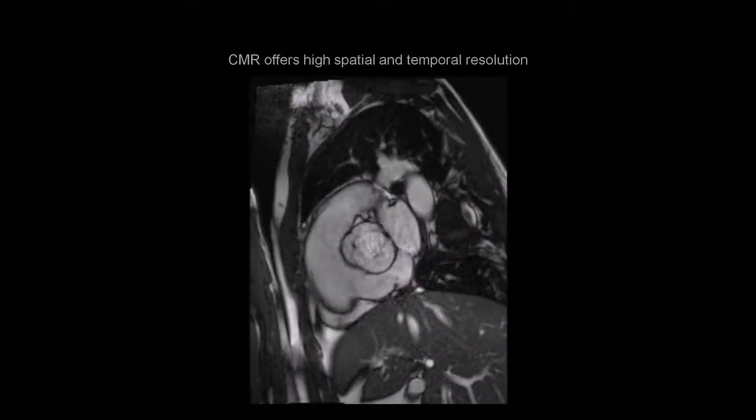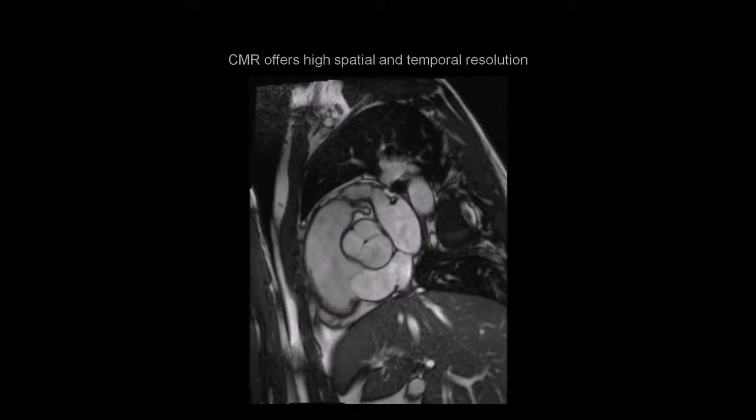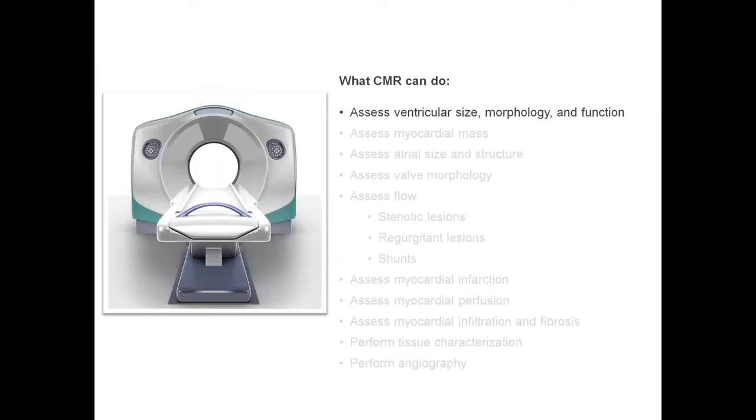It also offers us high spatial and temporal resolution, which can be invaluable in assessing cardiac anatomy, such as in this example here of a patient with a pseudobicuspid aortic valve. Unlike nuclear cardiology and cardiac CT, CMR does not use ionizing radiation or radioactive isotopes. And the versatility of CMR is immense.